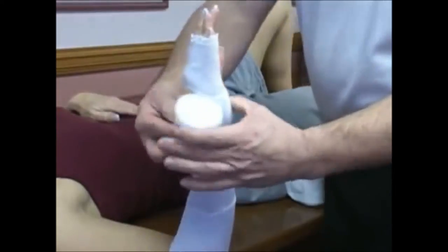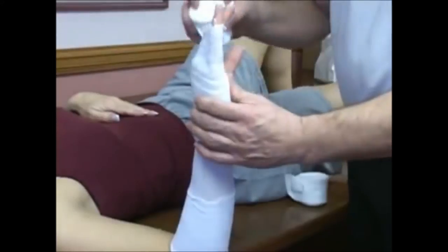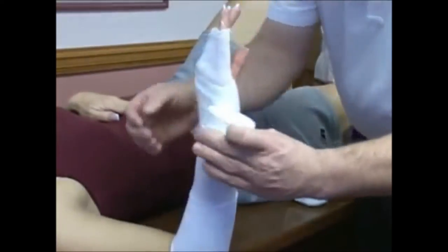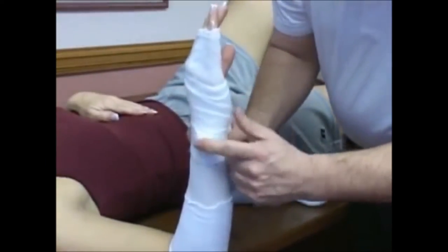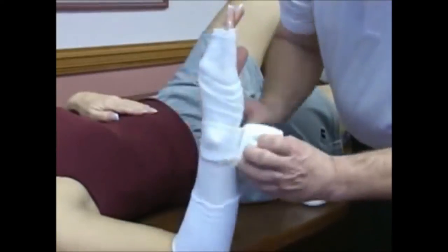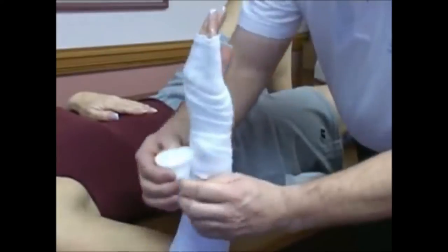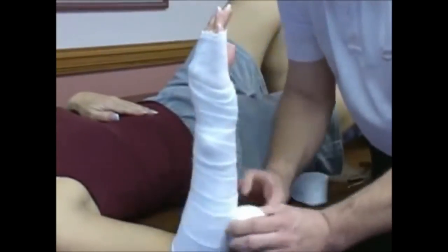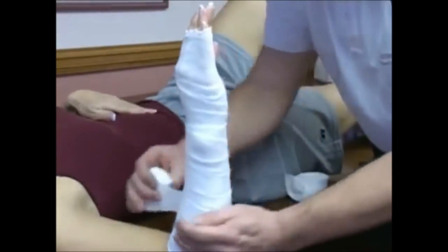I do two or three passes. I'll bring it out low around the hand. My next area of concern is a bony prominence — the ulna styloid. I do several passes over that, trying to protect that bony styloid. Bring it all the way down the wrist, stop it somewhere just before the bend of the elbow, usually about two finger breadths. Bring it back up.